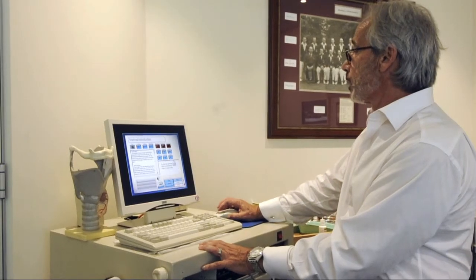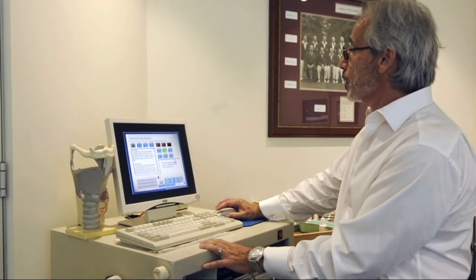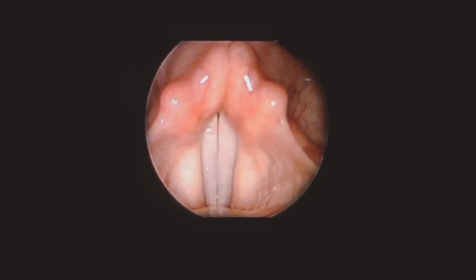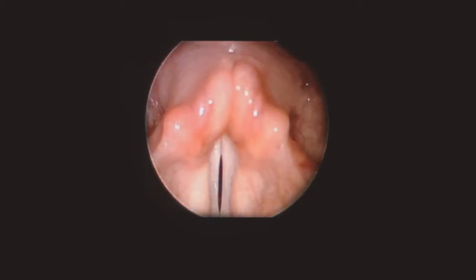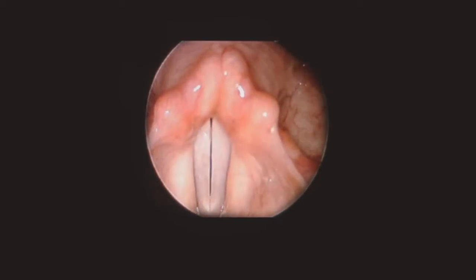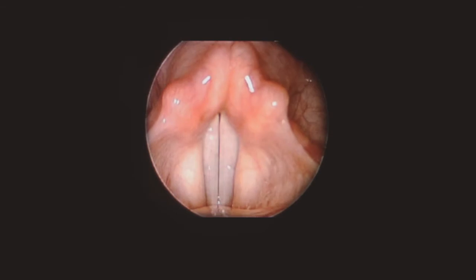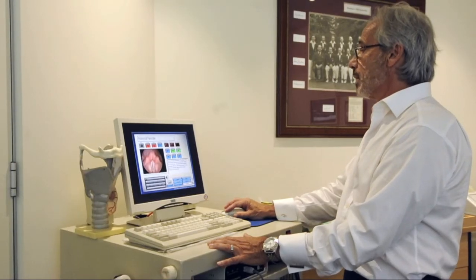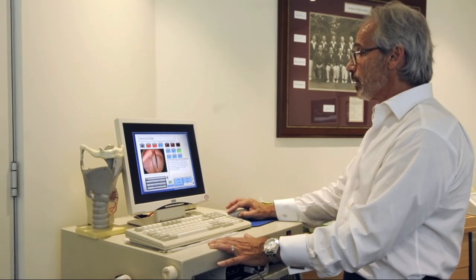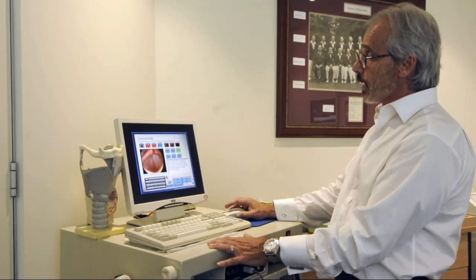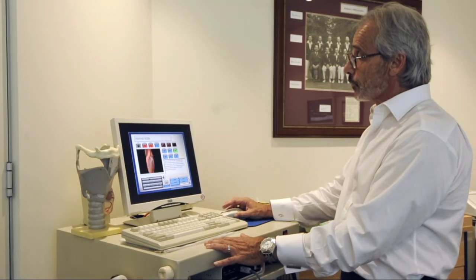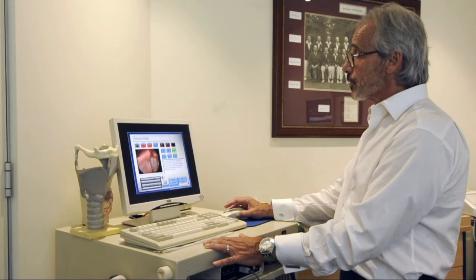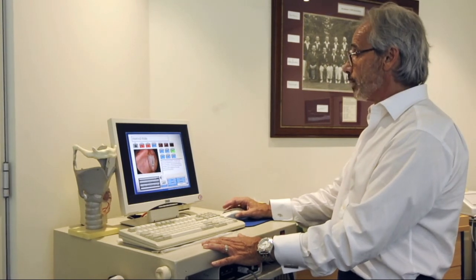To finish up, I'll show you a few more examples of normal larynges with normal movement: nice white vocal cords, symmetrical mucosal wave, good closure from front to back, and no inflammation or swelling of the surrounding tissue. And in a normal child or female, the same features apply — the larynx is smaller, with nice white vocal folds, good mucosal wave, no inflammation of the surrounding tissue, and no lining abnormalities.